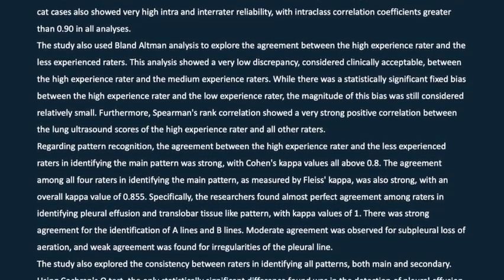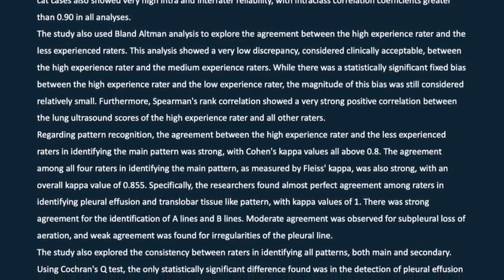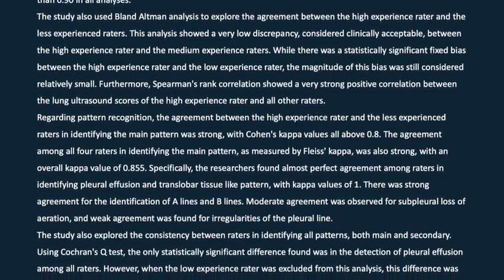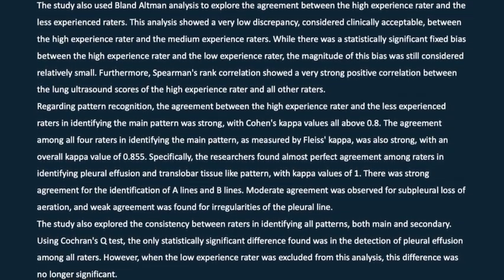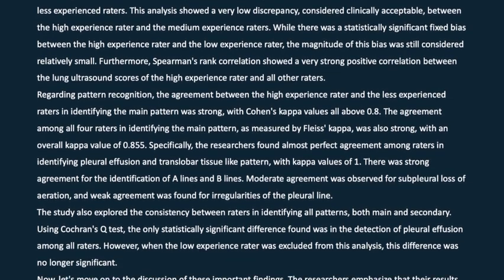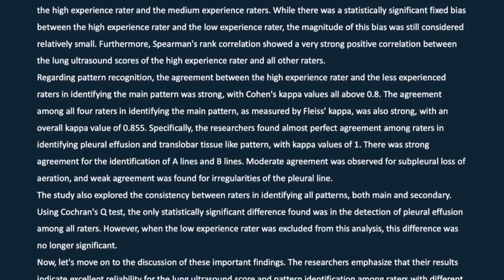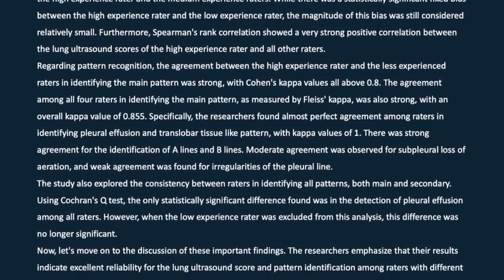Furthermore, Spearman's rank correlation showed a very strong positive correlation between the lung ultrasound scores of the high experience rater and all other raters. Regarding pattern recognition, the agreement between the high experience rater and the less experienced raters in identifying the main pattern was strong, with Cohen's kappa values all above 0.8. The agreement among all 4 raters in identifying the main pattern, as measured by Fleiss' kappa, was also strong, with an overall kappa value of 0.855.